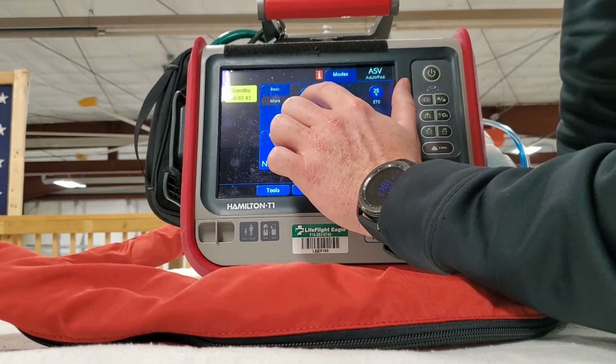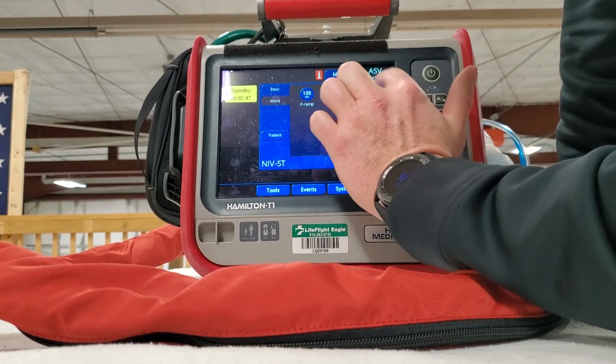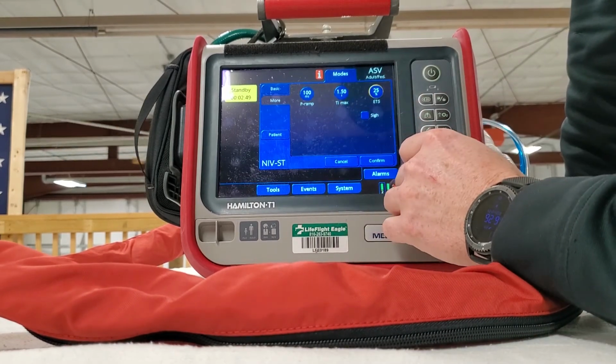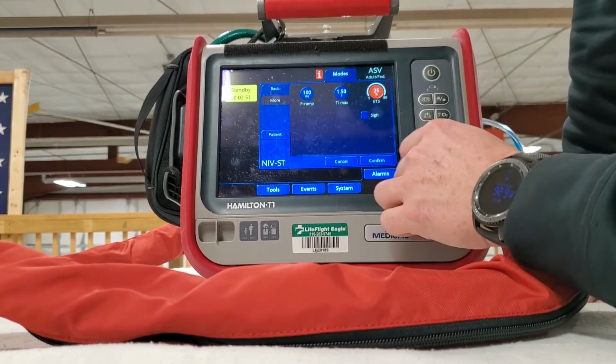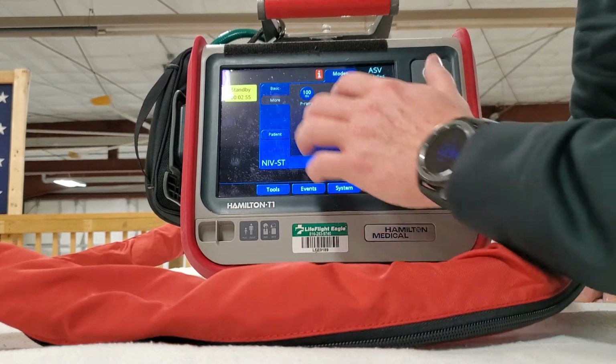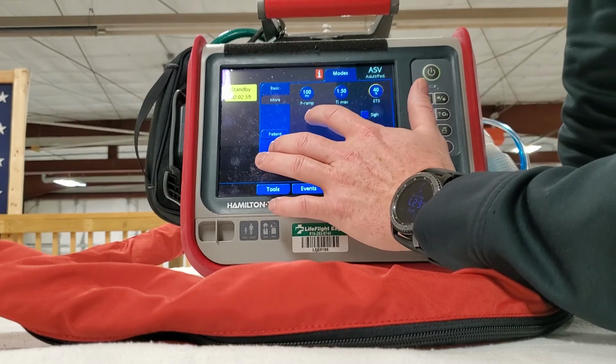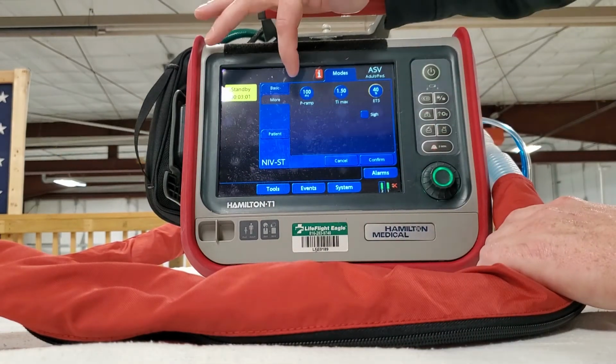P-ramp again, we talked a little bit about. You can do ETS. I don't know how much it's going to help, but if you have somebody that you need to help ventilate more than oxygenate, you increase it usually to about 40. This helps them exhale better. TI max, I don't mess with. We'll let the Hamilton guy explain that to you.